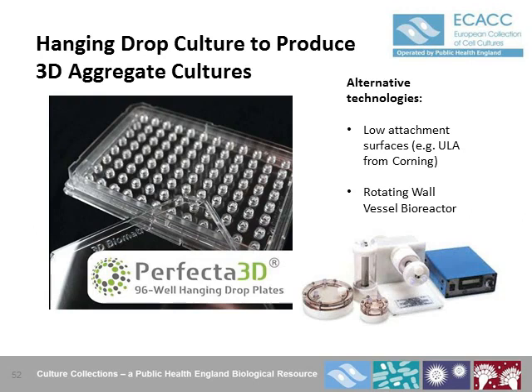If you remember, in 1907, Harrison used the hanging drop technique to culture his tadpole neurons. Novel hanging drop plates, in this case Perfecta plates, can be used to generate 3D spheroid cultures in multiple replicates. Other available technologies for spheroid generation include Corning's ultra-low attachment surface and the NASA rotating wall vessel bioreactor.